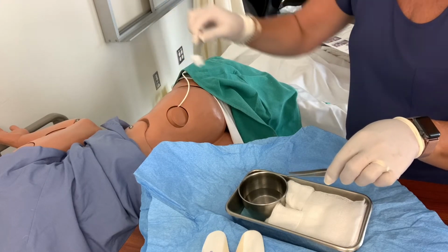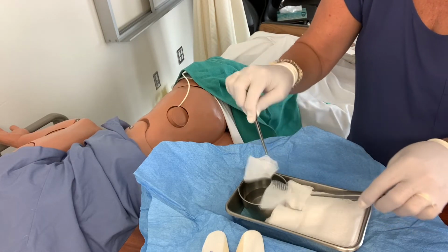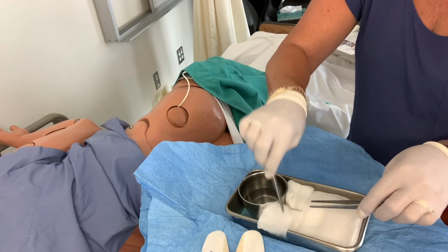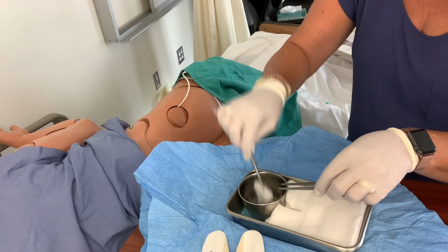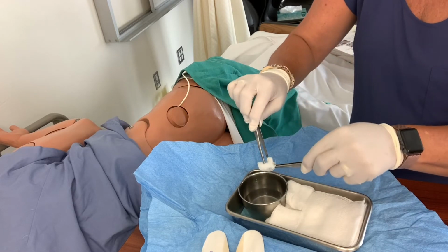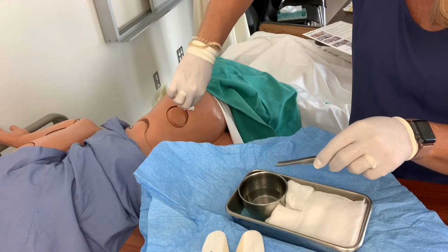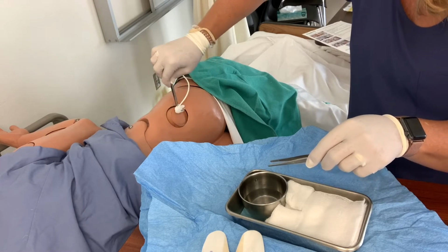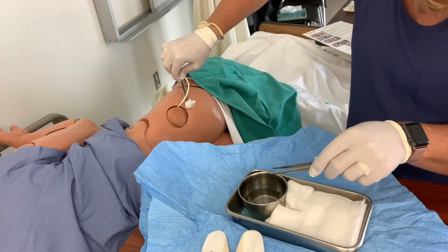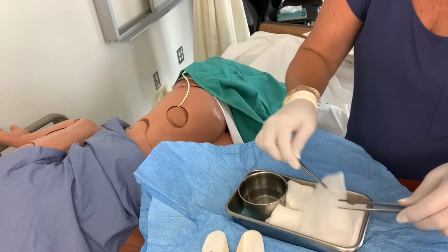Whenever I lift the gauze, then the gauze becomes garbage. So you can't keep lifting the gauze and setting it down. You just want to set it and lift it once, and when you lift it, consider it dirty. Okay, so I'm going to come on this side, and come around as far as I can, and keep working my way around the dressing.